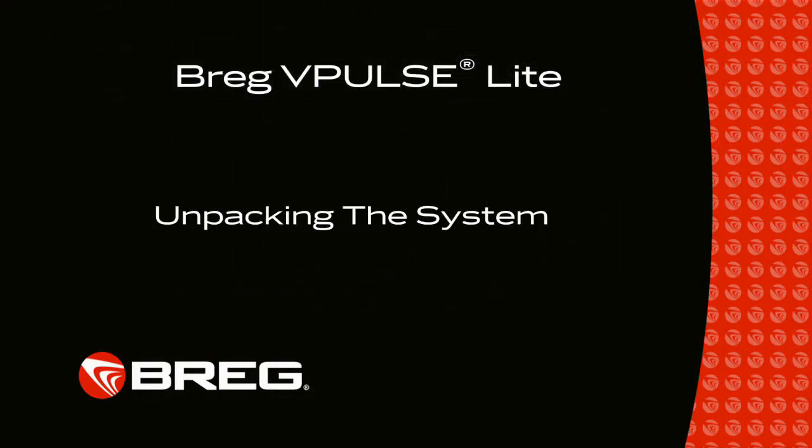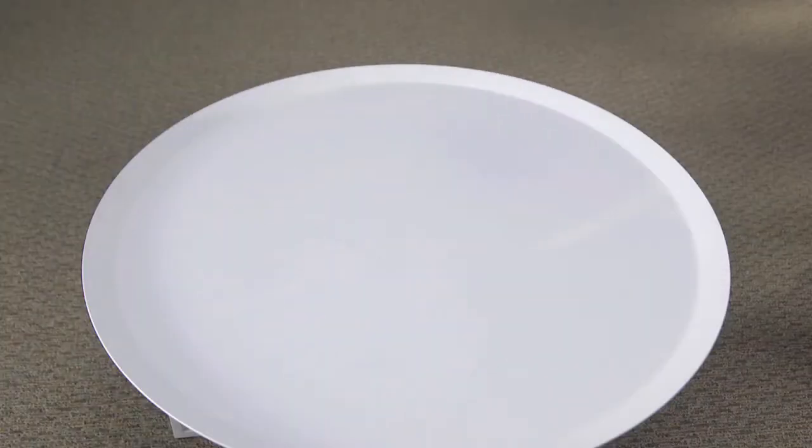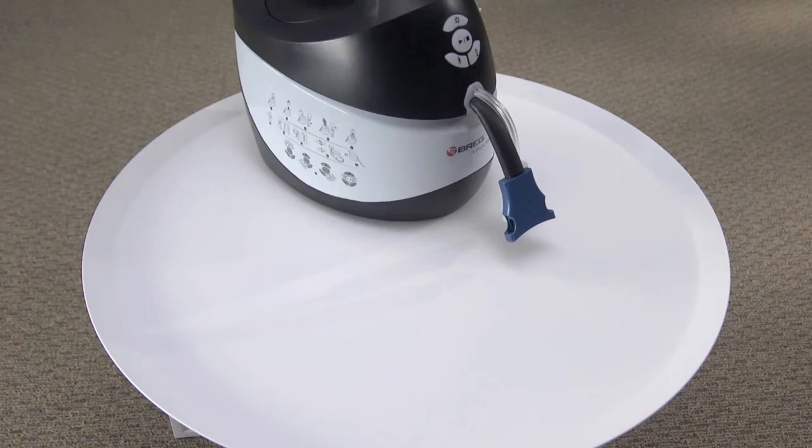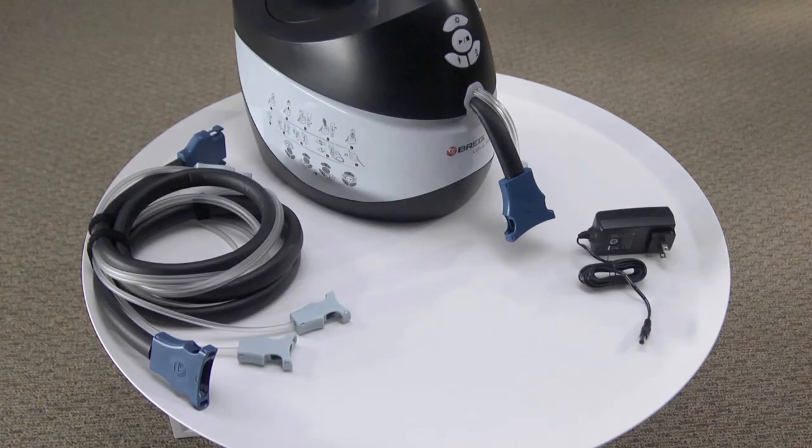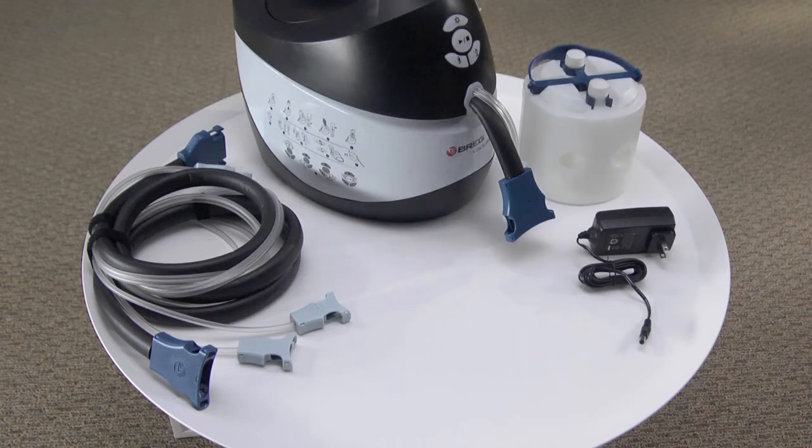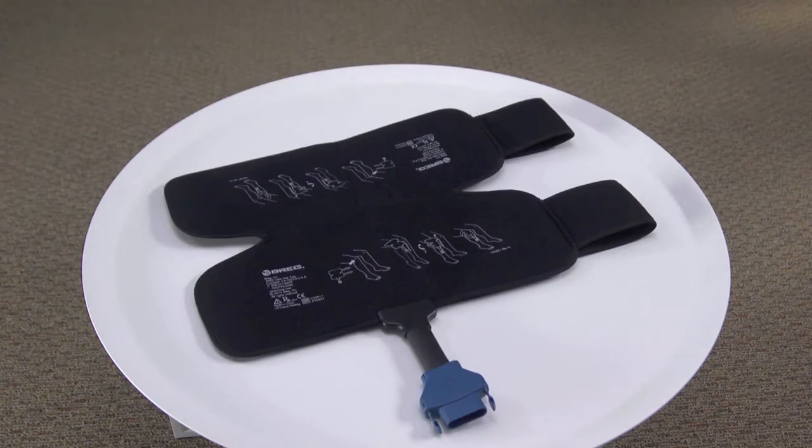This video will explain how to operate your Bregg V-Pulse cold therapy and wound compression. Your V-Pulse system comes with a container, a tubing set, a power wall adapter, ice bottles, and a user's manual. You will also receive one thermal compression pad specific to your needs.